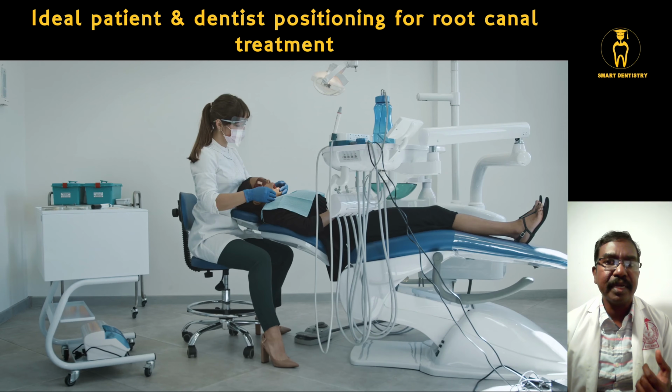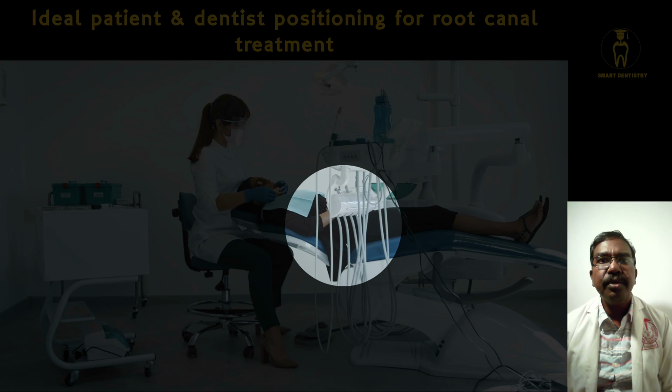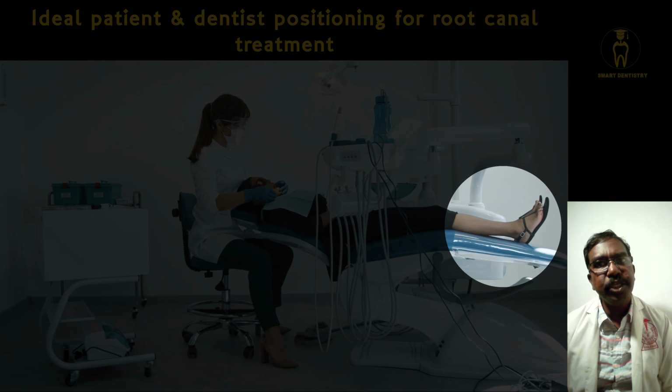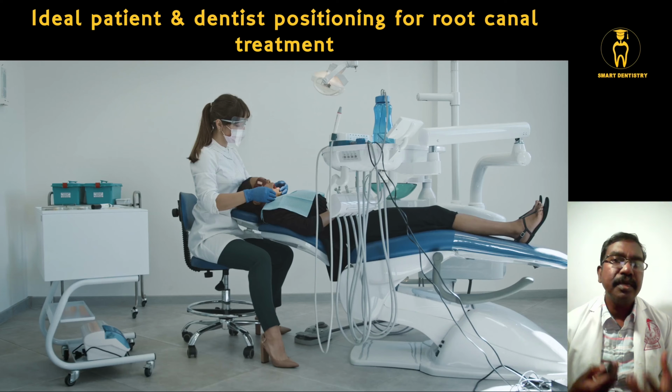But I would recommend that while doing root canal treatment, this is the position which is needed so that there will be no issues, and it will be easy to access the root canal.